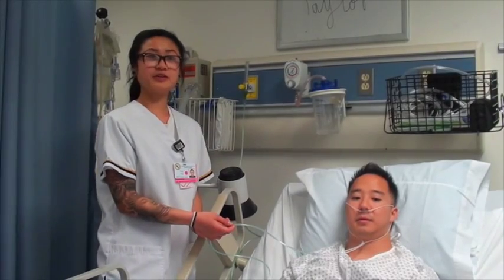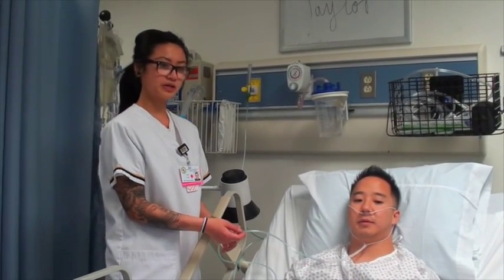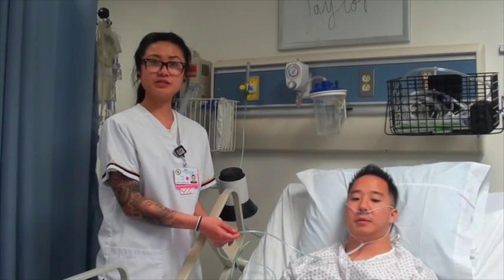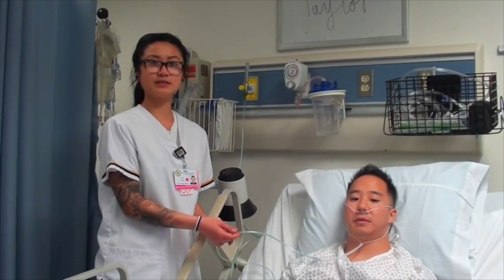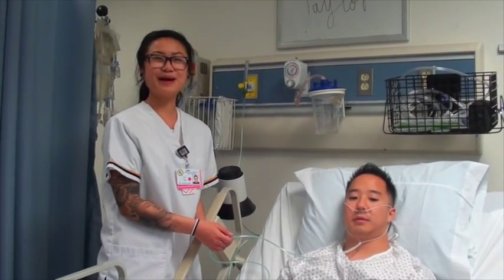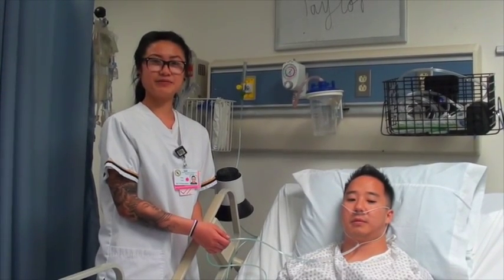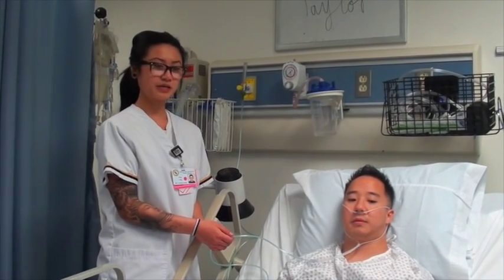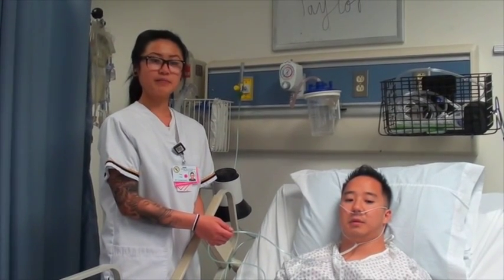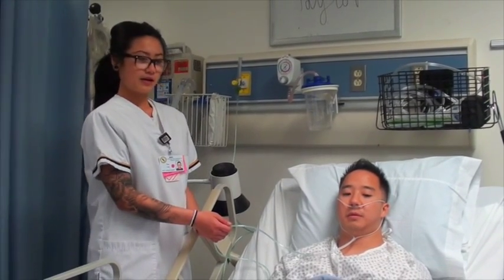There are some nursing considerations when administering O2 via nasal cannula. If the order is for a flow rate above 5 liters per minute, it is important to use a humidifier because it could prevent the patient from having dry mucous membranes, which could be very irritating. Also, patients with COPD can tolerate about 2 liters per minute, but if the order is anything above that, then you might want to question it.